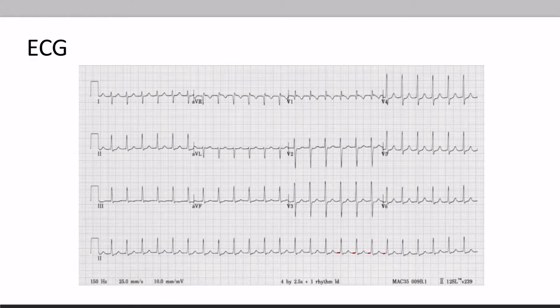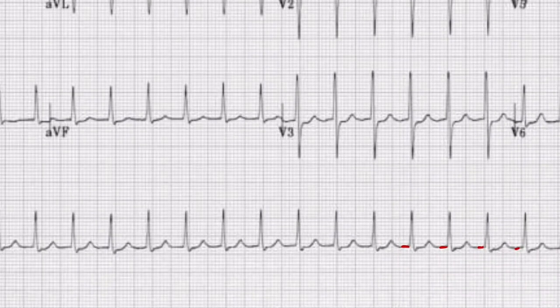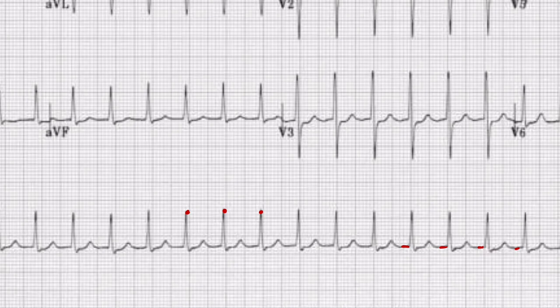The first step is finding the rate. We'll zoom in and use these R peaks that line up pretty nicely on the edges of these big boxes, and we're going to count the number of big boxes between these peaks. One box, two boxes — we'll divide that into 300 to give us about 150 beats per minute. It looks like it might be a little less, so between 140 and 150 beats per minute.